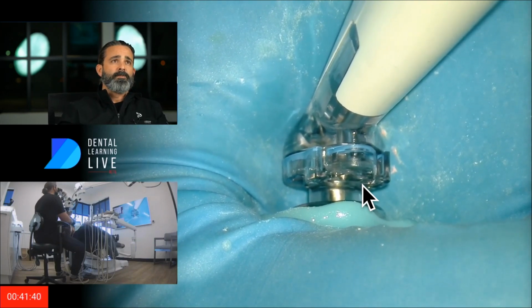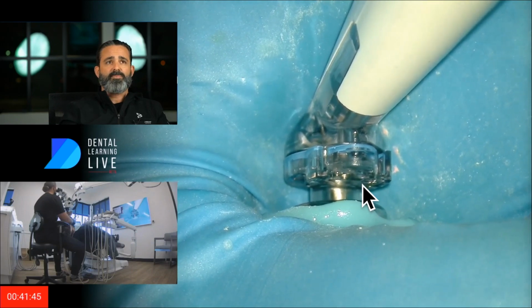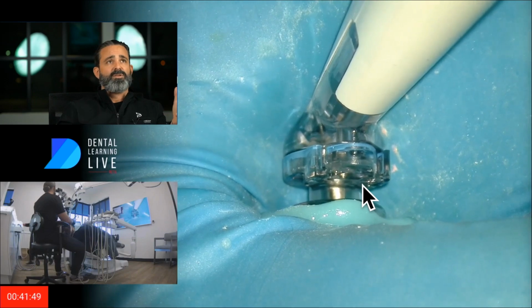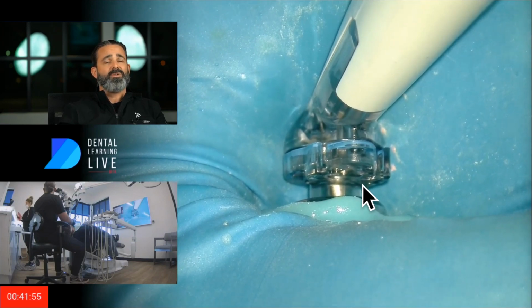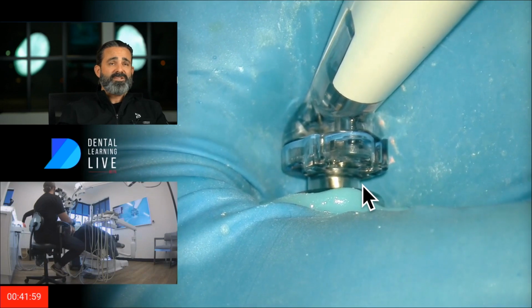The nice thing is, we all probably have our own rubber dam techniques, but in my technique I'm using Orasil, rubber dam, and then sound seal. There's a triple decker layer there, right? A triple decker sandwich of different materials to be a barrier so the patient does not taste bleach.